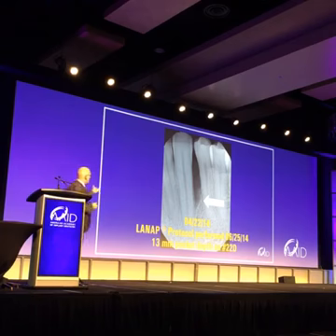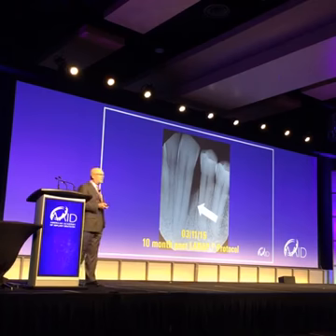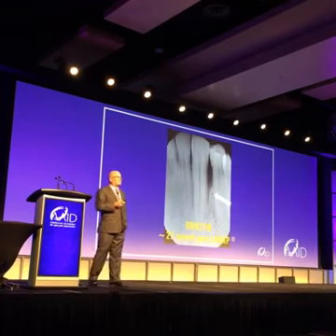Here's another case. A 13 millimeter pocket. I mean, how are you going to, you can try to regenerate that, I guess, but it's a lot of surgery and how much tooth is going to show, etc. Maybe just take a tooth out, graft it, see what happens. 10 months later, that's what it looks like.